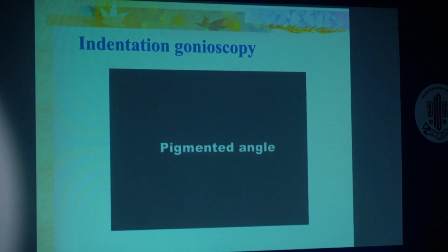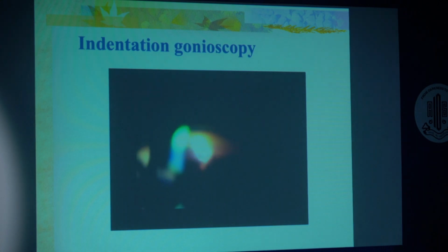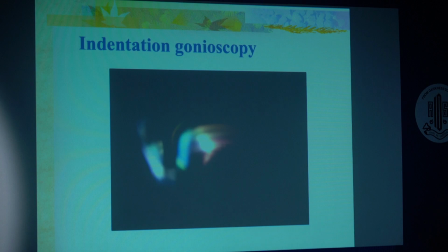Then you also see a pigmented angle. Sometimes you see a lot of pigmentation in the angle. Sometimes it is a pigmentary glaucoma, sometimes even in a diabetic patient, a pseudoexfoliation glaucoma, if it's a pigmented angle.